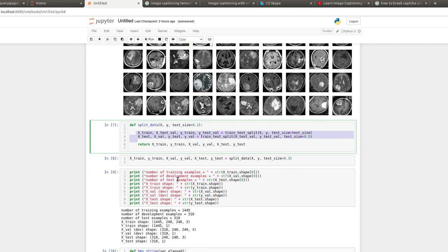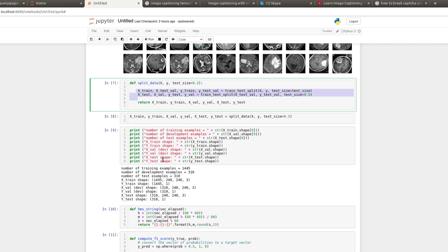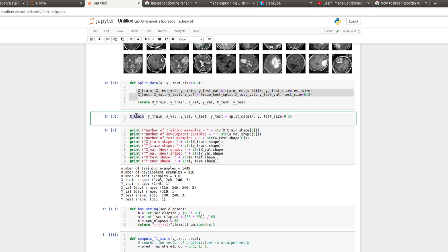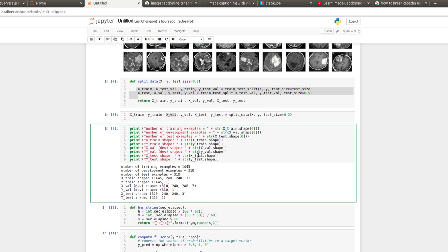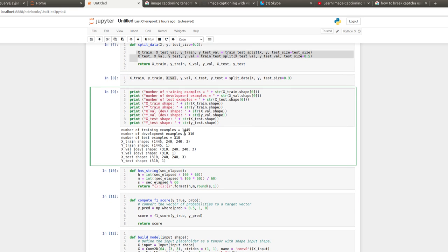and test sets. X_train for training, X_validation containing some images which will be used for performing the validation accuracy. Here, the total number of training examples I have used is 1,445, and the test examples are 330. The shape of the images is 240 by 240, and 3 stands for the RGB bands.